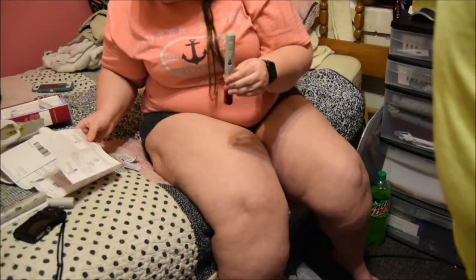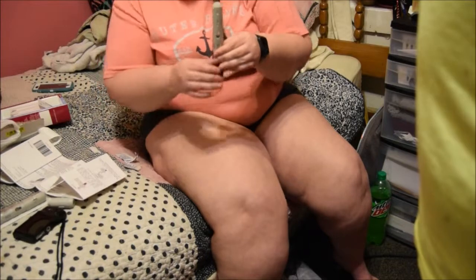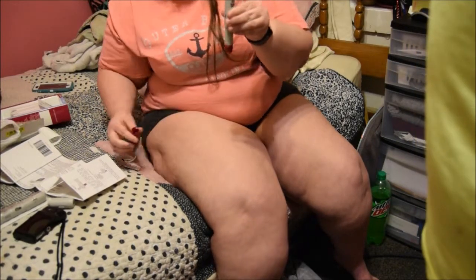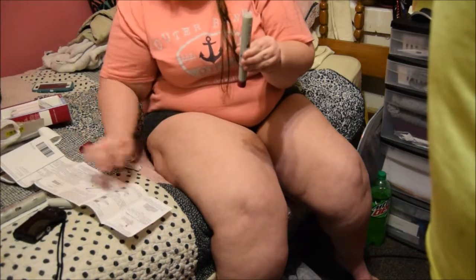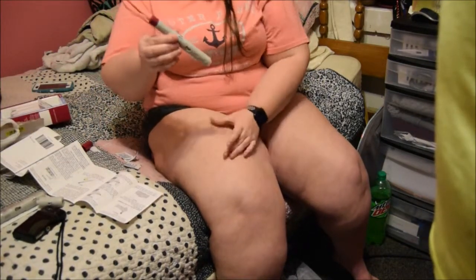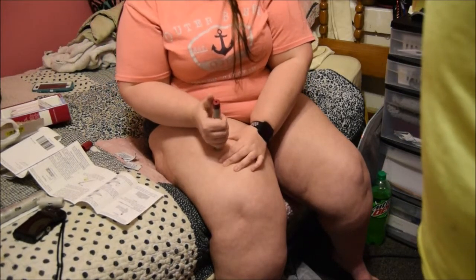Where does it say to take the other one off? Plum color, the pen. Okay, so then I take this one off. Okay, so there's that one. And then I turn it around. Yep. Squeeze. I already put the wipe on there. So I squeeze. In 10 seconds.